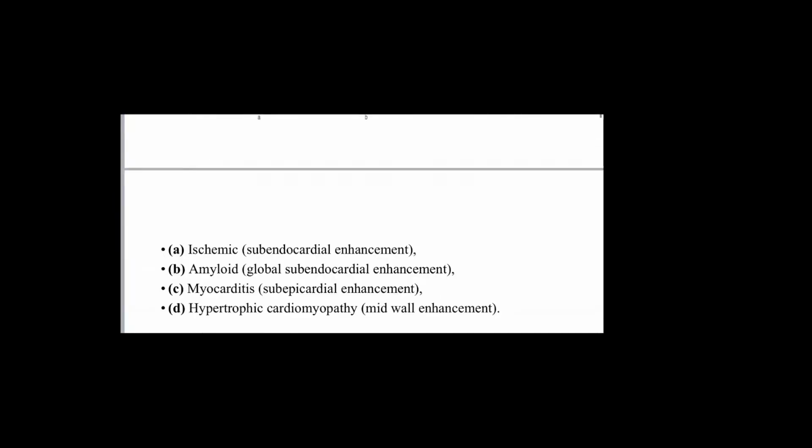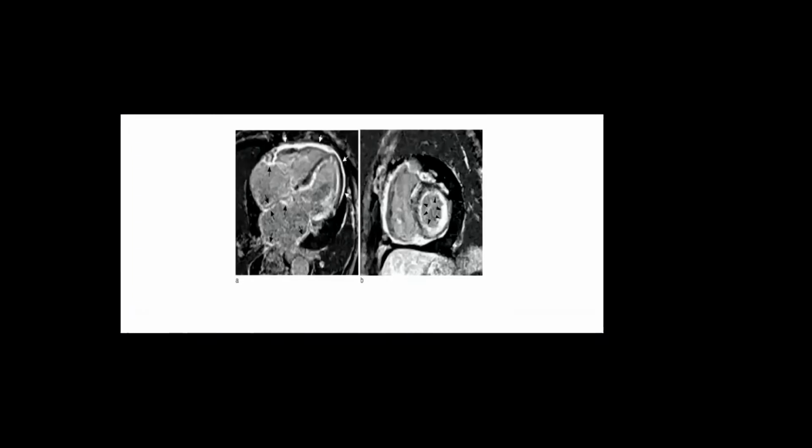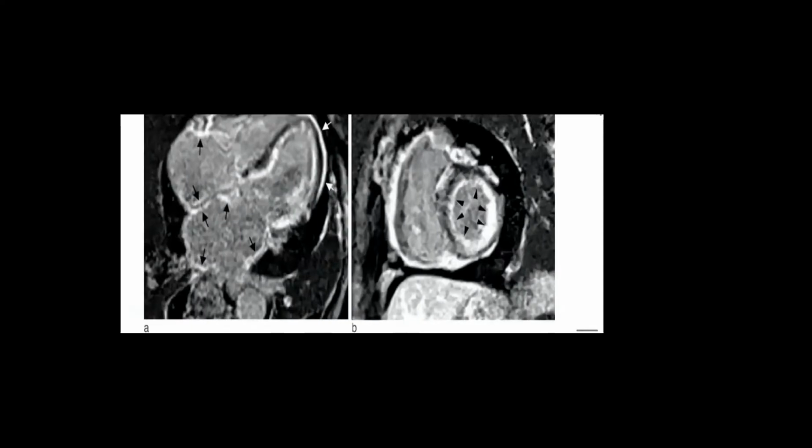Again, look at it here. Can you see? Okay. You see here, usually this is a delayed hyperenhancement pattern. So the delayed hyperenhancement with gadolinium is not seen this way. That's abnormal. It accumulates in the entire endocardium. So there is global subendocardial hyperenhancement. What's the meaning of this?